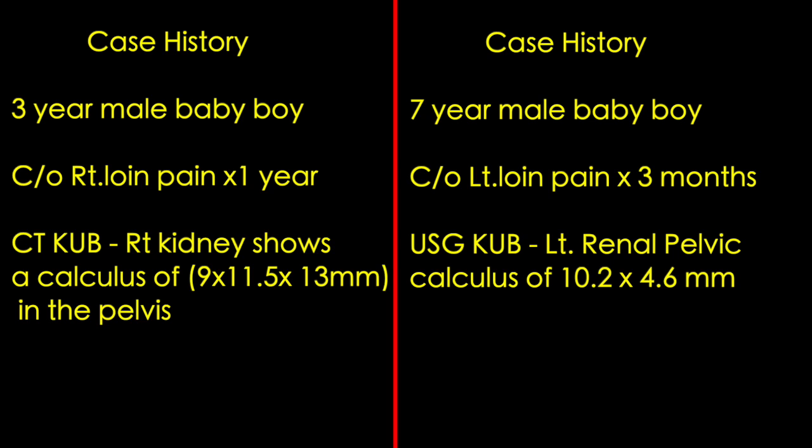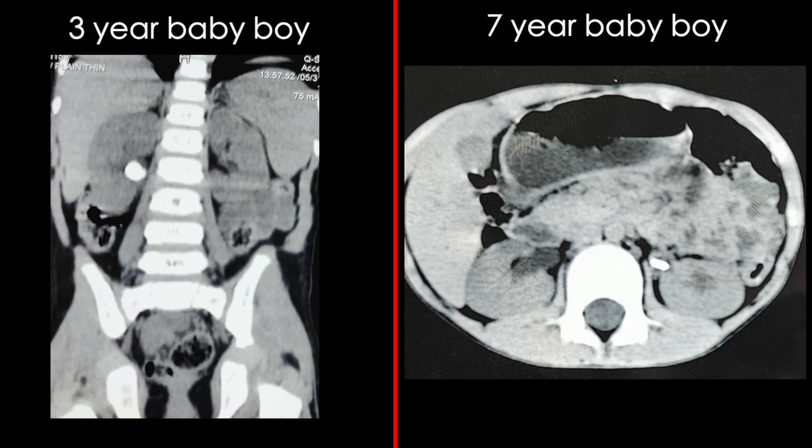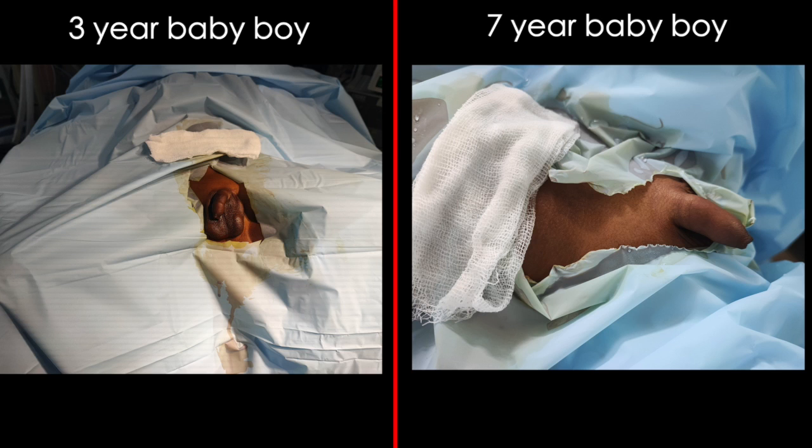The three-year-old boy has a large stone volume measuring 13 by 11.5 by 10 mm, whereas the other stone is thinner. One stone is round and the other is flat, but they share the same consistency at 500 Hounsfield units. Both patients have small external genitalia.